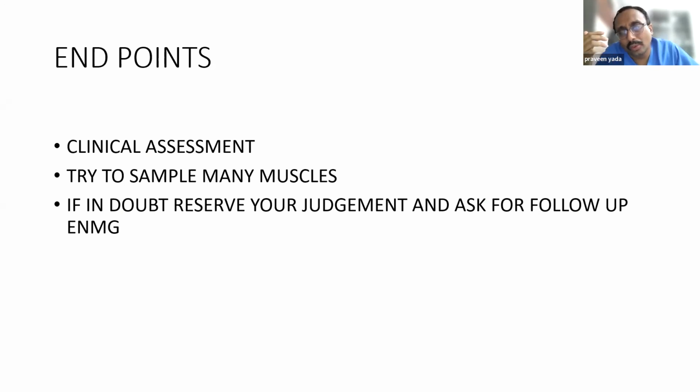Other cases, especially radiculopathies, we clinically think that this is a radiculopathy. We will check only one limb. Don't do that. Always sample a muscle from the other limb and sample from the upper limb also.